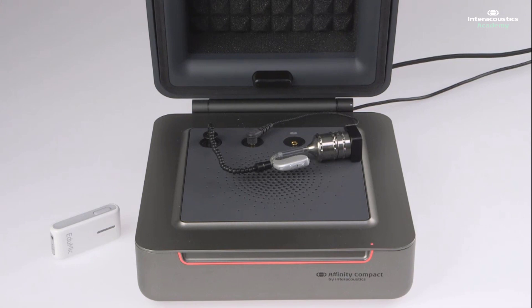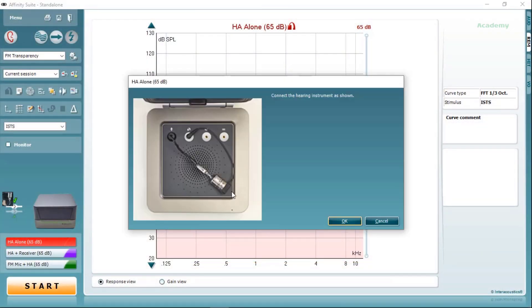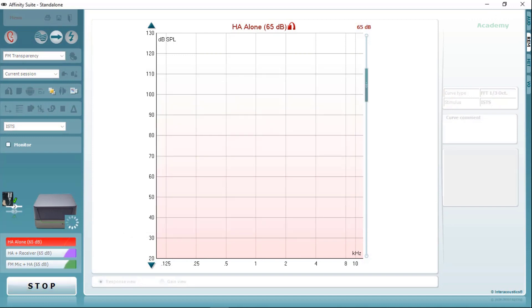First of all, we need to measure the response of the hearing aid on its own. Therefore, we place the hearing aid in the test box as we normally would have it positioned, and press OK. We will then present a 12-second ISTS signal to the instrument, and this will record the frequency response on the screen.